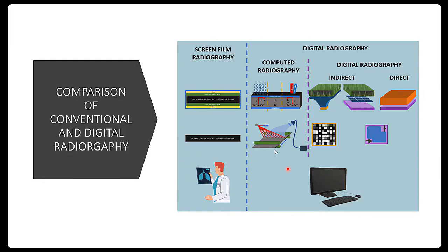PACS is a networked group of computers, servers, and archives that can be used to manage digital images. Okay, so PACS is simply a network of computers. It's a group of computers which will provide the services for archiving the informations. Okay.